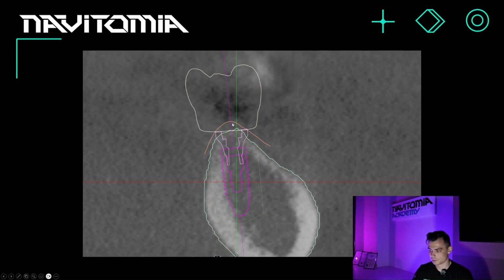Here's another example. The patient has a rather thin gum biotype, but even so, this positioning is much better, because with this placement, it becomes possible to make the crown in such a way that a gingival collar can form. In other words, the crown will appear as if it emerges from the gum, making it more aesthetic. Additionally, the gum in the cervical area of the crown will naturally adhere to the crown itself, forming a protective seal, and thereby effectively help to prevent food particles and debris from getting in there.